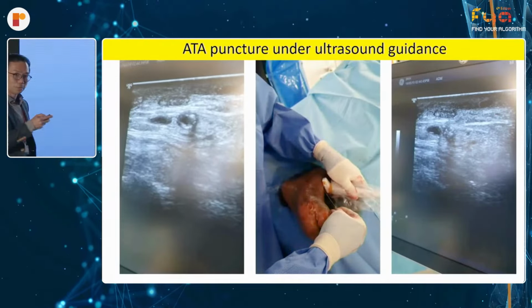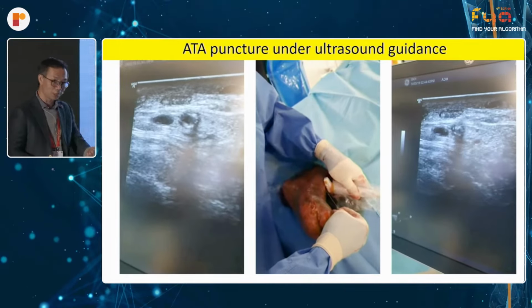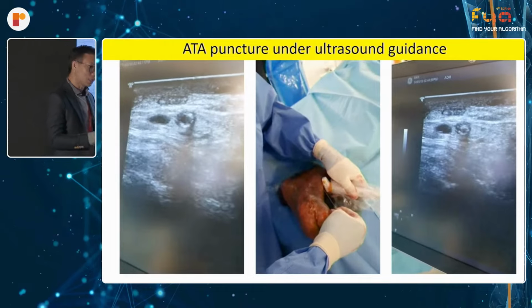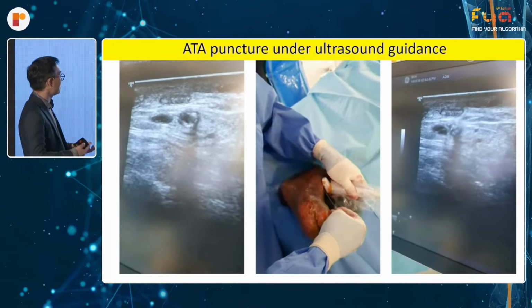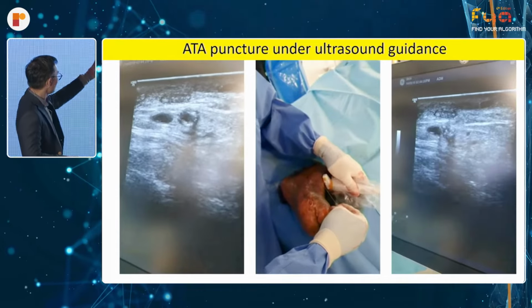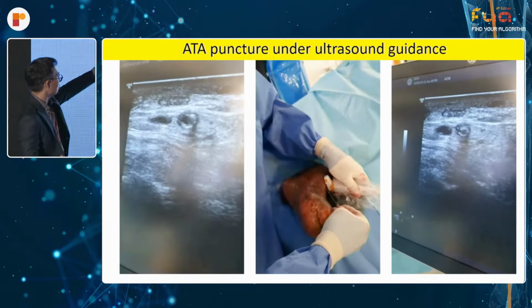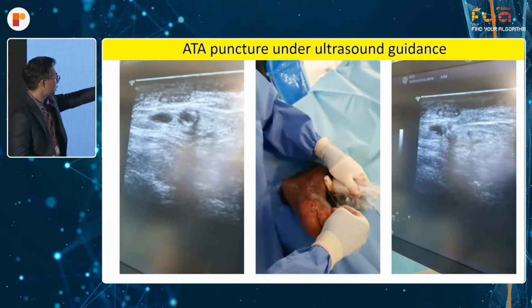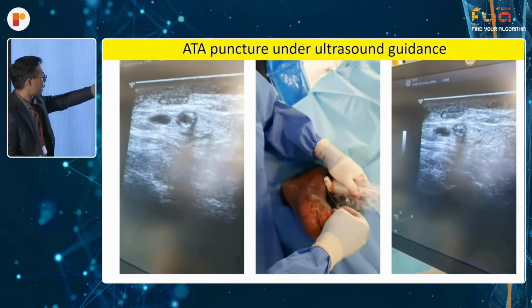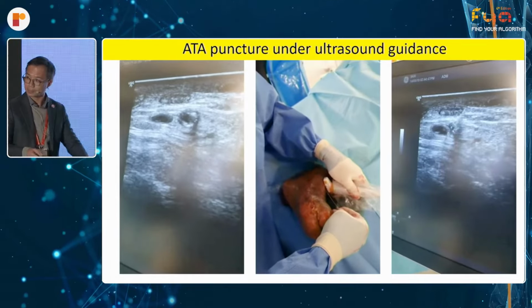So in terms of the punctures, there are many arteries down below that you can puncture. The ATA, first of all. For the ATA, I think the best technique, in my personal opinion, is to use ultrasound guidance. You can see normally there's a vena comitans next to it. There's a calcified portion of the anterior tibial artery. I generally use a hockey stick, and then I puncture in a transverse fashion into the middle of it. Here we are, transverse fashion.